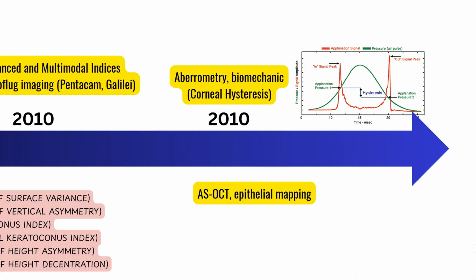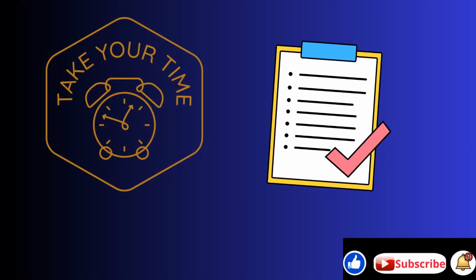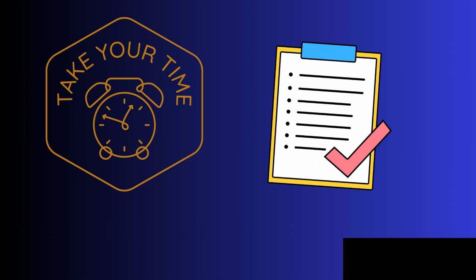We'll try to do justice to each of these diagnostic tools, so I encourage you to watch this lecture in your leisure time with a pen and a notebook handy to take notes.